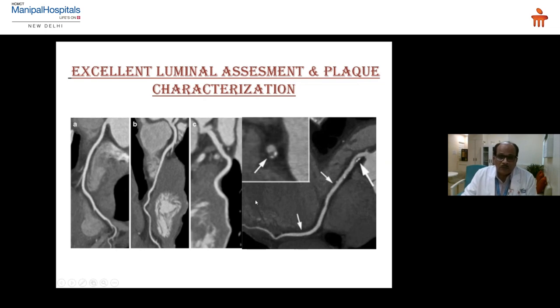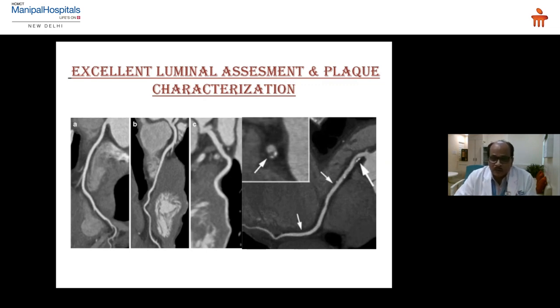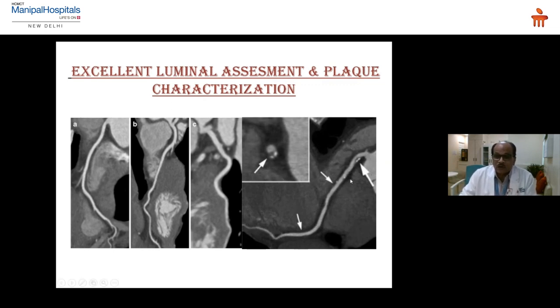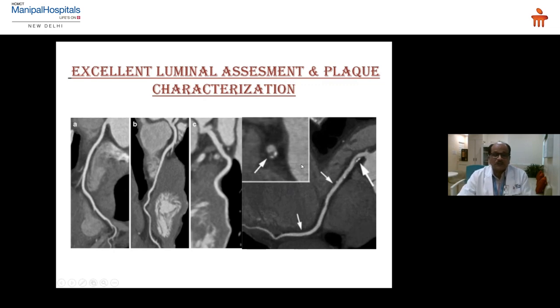With MDCT, by plaque characterization, we can determine whether there is a vulnerable plaque or not. Various CT characteristics of vulnerable plaques include: a necrotic lipid core, a napkin ring sign, and surrounding inflammatory changes — these are all considered features of a vulnerable plaque and can be identified with CT scan.